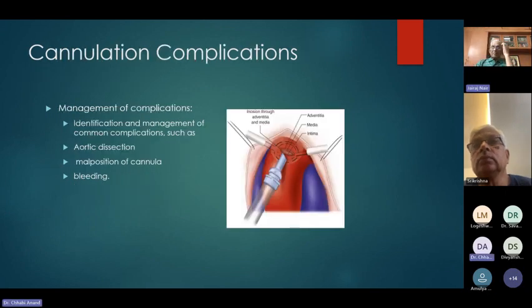Cannulation complications, management of complications: identification and management of common complications such as aortic dissection, malposition of cannula, and bleeding.